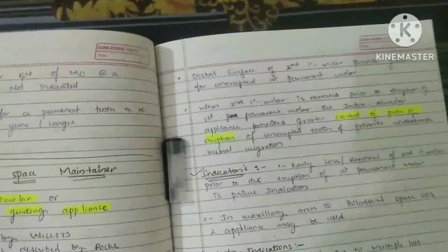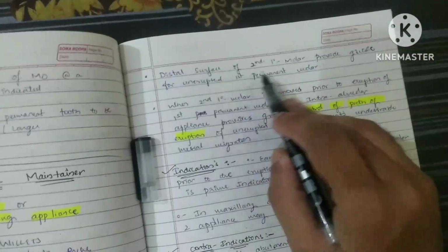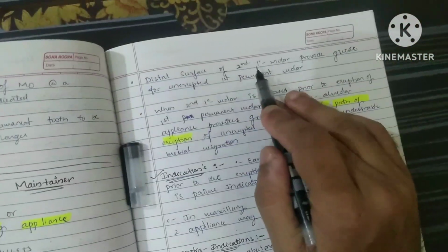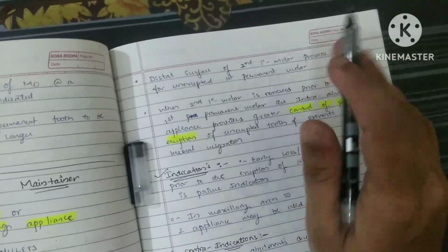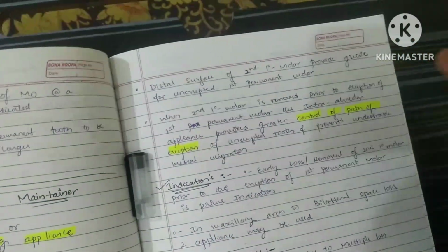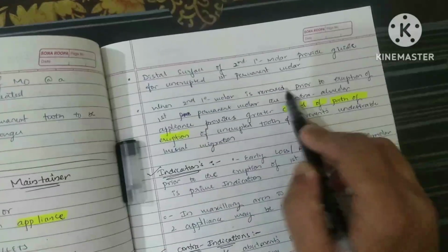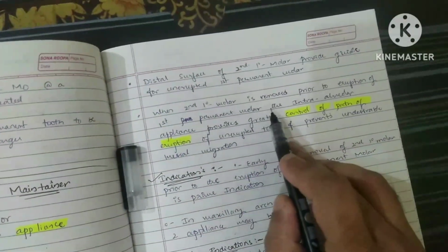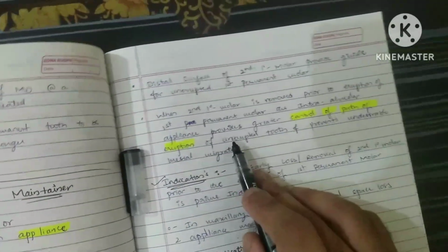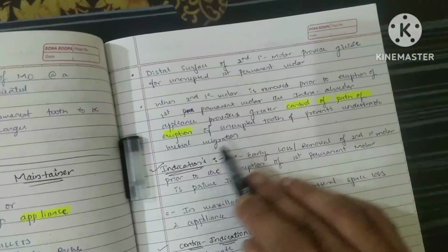Now the distal surface of the second primary molar provides the guidance for the unerupted permanent first molar. This is going to provide the guidance sequence for eruption of the first permanent molar. When the second primary molar is removed prior to the eruption of the first permanent molar, the intra-alveolar appliance provides greater control of the path of eruption for the unerupted tooth, and hence prevents the mesial migration.